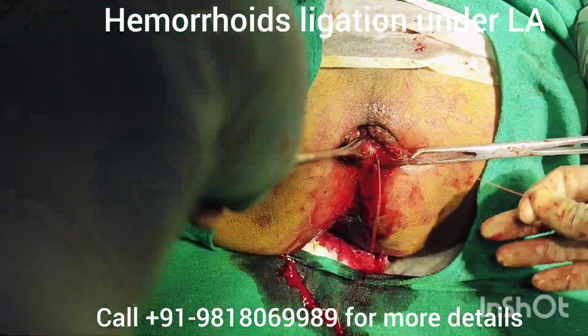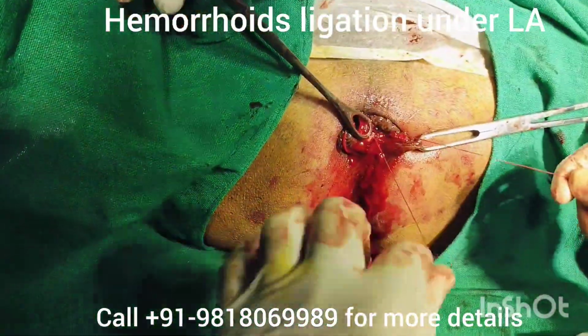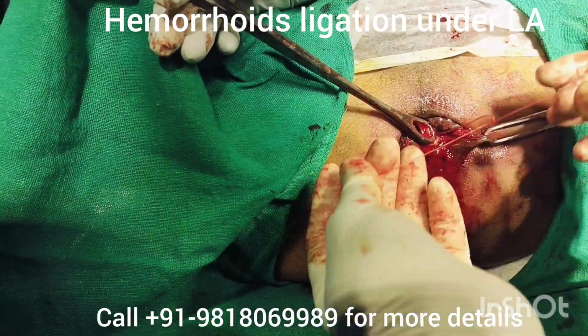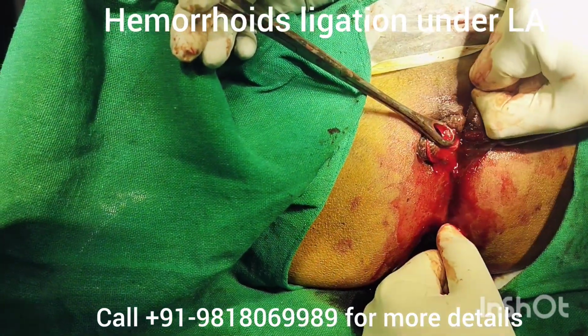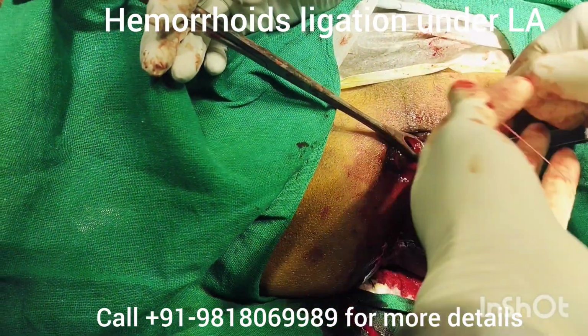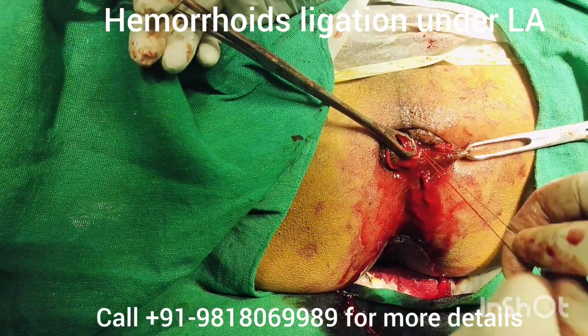The entire surgery almost took 15 to 20 minutes to ligate all the three pile masses completely.